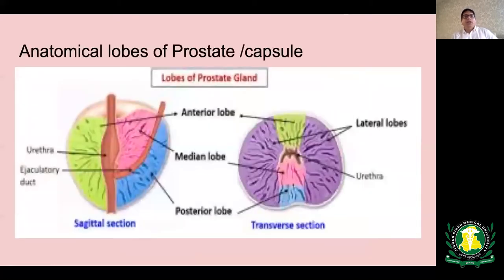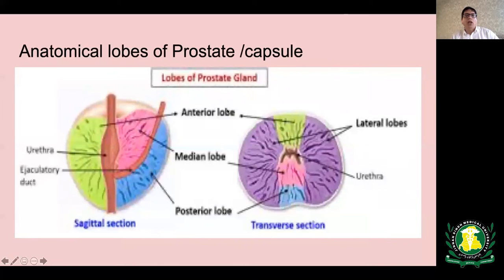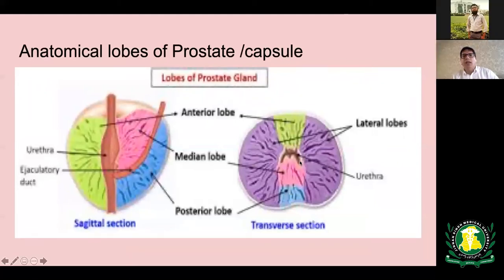The lobar anatomy of the prostate uses the prostatic urethra as an arbitrary dividing line. You have the anterior part of the gland anterior to the urethra on the sagittal section, and the posterior part lies behind the ejaculatory duct. Between the prostatic urethra and the ejaculatory duct, you have the median lobe. On axial slices you have the anterior part anteriorly, the posterior part posteriorly, the median lobe in the middle lying behind the urethra, and the lateral parts of the gland on either side.